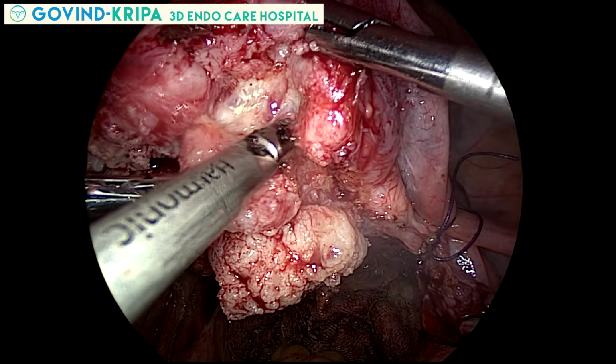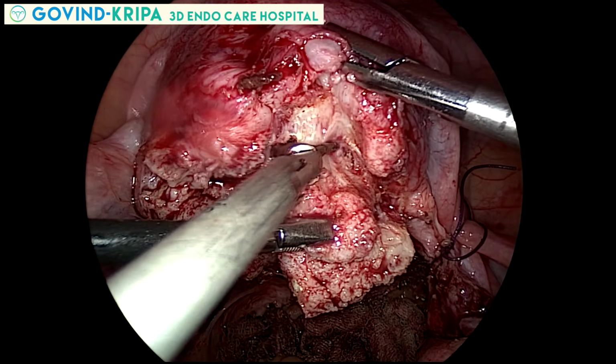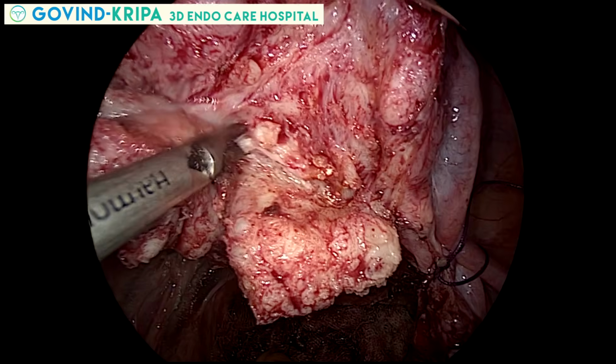One should remember that we have to maintain at least 0.5 centimeter of the serosal wall to achieve good reconstruction afterwards.